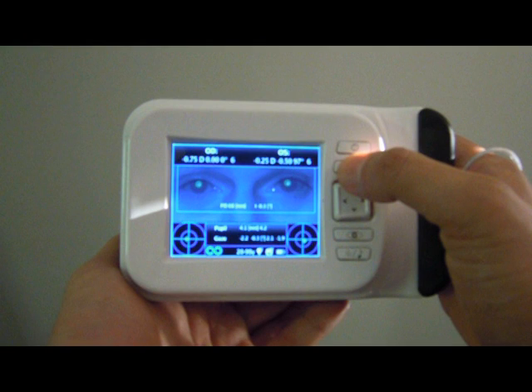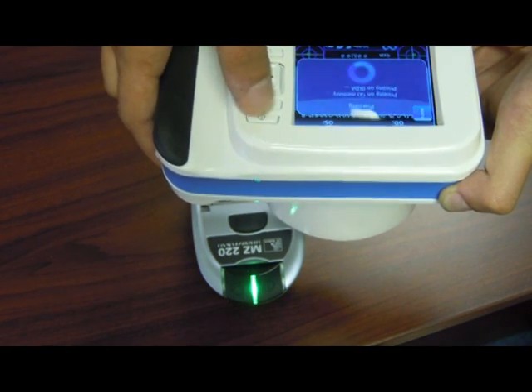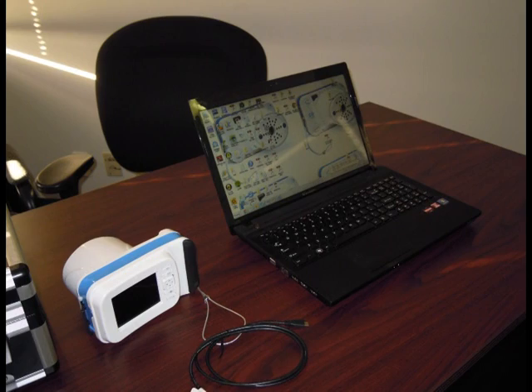The measurement results can be printed on a portable printer. Point towards the printer and press the print button. A blue light flashes on the printer and the report is printed. The report can also be saved on the device, uploaded to any computer, and printed on any printer.